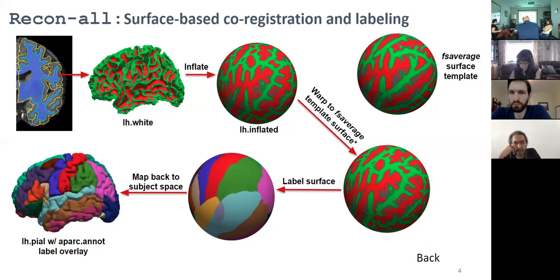But the more standard approach would be just to create one single template with all of your data, trying to make it relatively balanced in the contribution of the different subgroups, and then use the rest of the tools that you have to look at the individual properties of individual subjects where those differ between the two groups, rather than comparing the actual templates themselves, like group-specific templates.